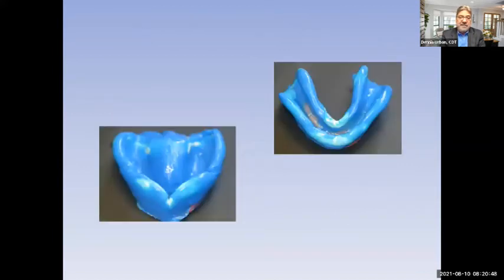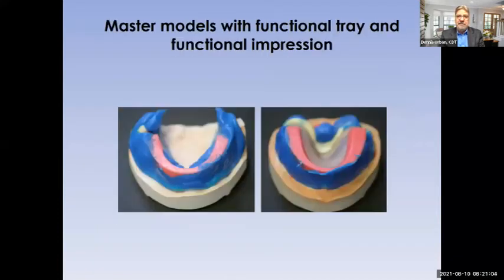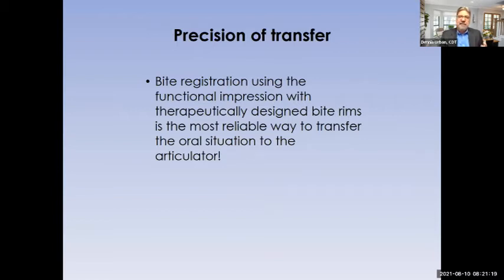This is the final impression from a doctor who liked large, full borders — heavily border molded in the periphery areas. The doctor also took an occlusal registration and we poured the models. A functional impression with therapeutically designed bite rims is one of the most reliable ways to transfer the oral situation to the articulator. We want to feel like we have that patient at the bench with us, because all we really have is an articulator — the more information we get, the better.